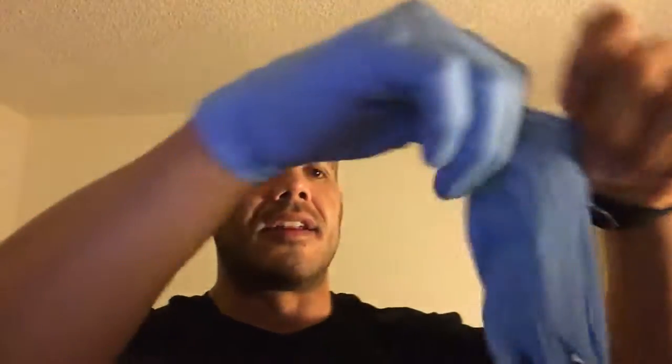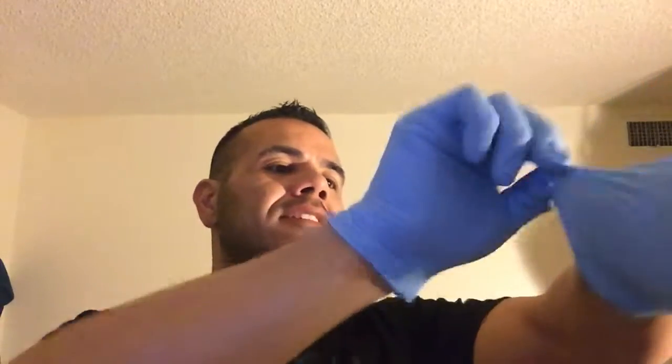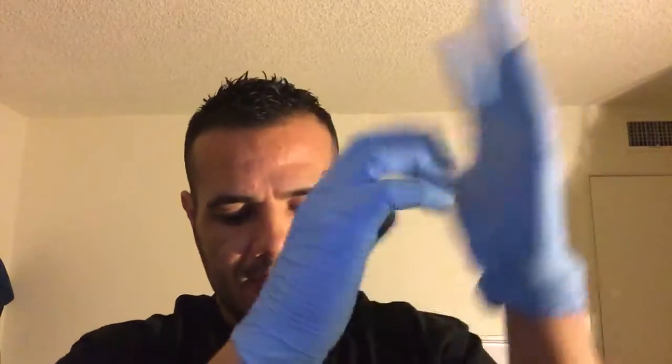So I'd wash my hands, pretend you didn't see this, and then I'd don gloves. I know that's a weird word. I hate saying it. Don. But I'm going to put gloves on, whatever. So my gloves are on. I'm going to get a blood pressure reading from my patient. If blood pressure is too low, I'm going to hold the drug and I'm not going to administer. Our patient's within range. He's cool, so we're going to proceed.